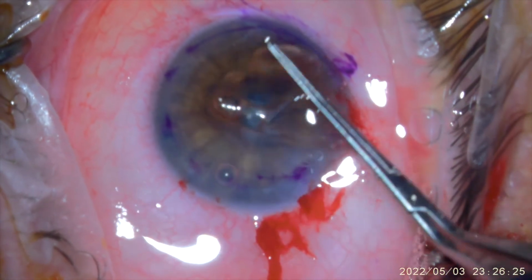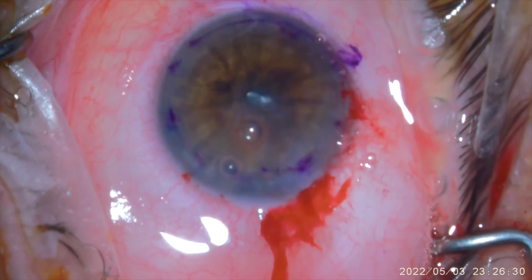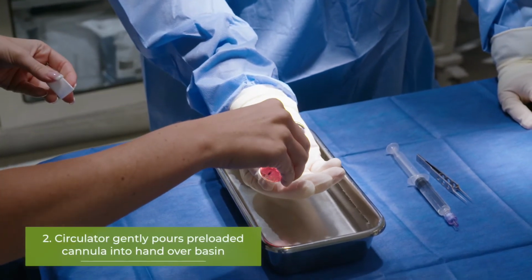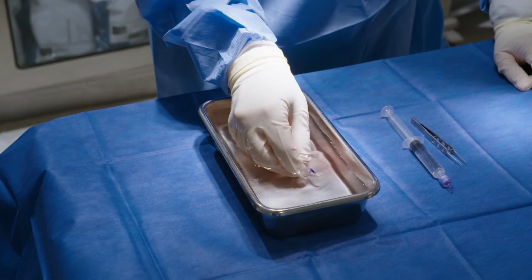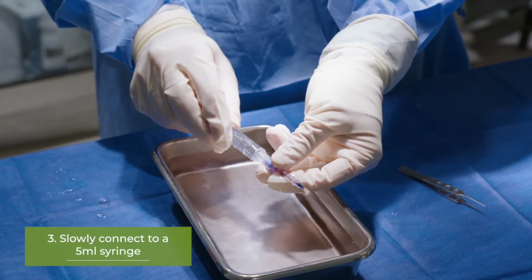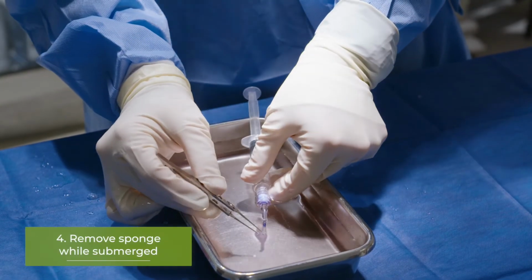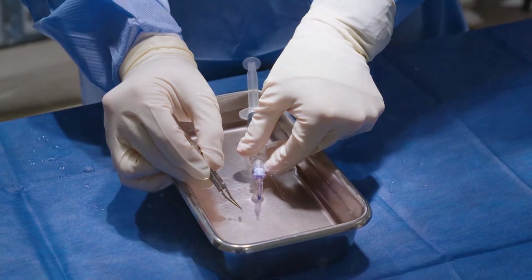After removing the viscoelastic from the eye, I am already ready to get the transplant ready. This is the transplant ready system from Leader. We have BSS underneath in a basin, which provides a nice safety net. I take the transplant ready Leader tissue and I connect it. Now I do this submerged in BSS. This ensures that no bubbles enter the end of the cannula.